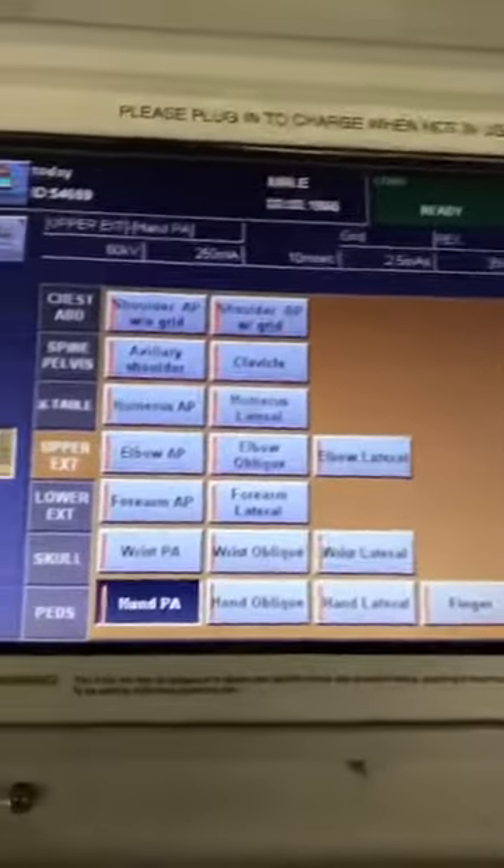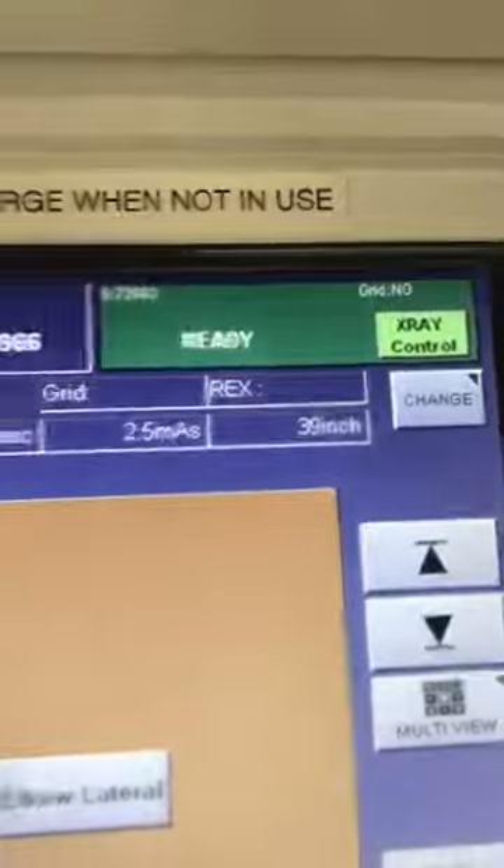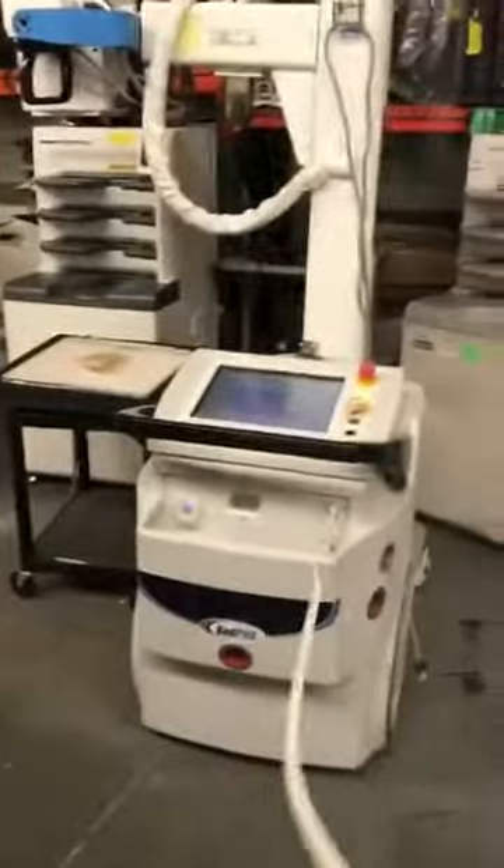We've set up a patient here and I'm just going to do a hand because I've got the hand phantom on the DR. It says ready — we basically just registered a patient and set it up for a hand.